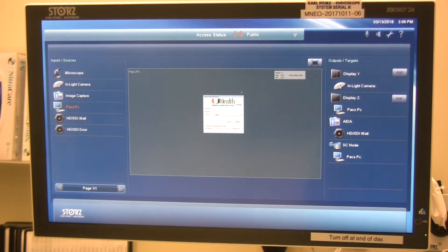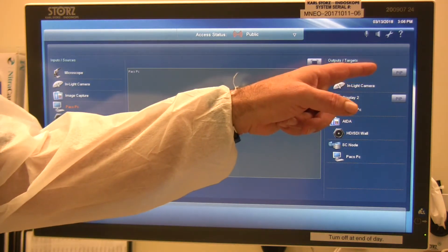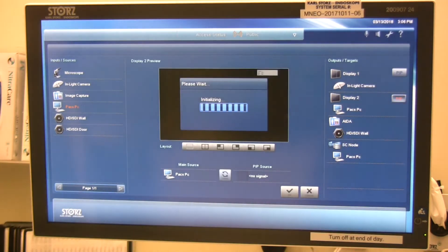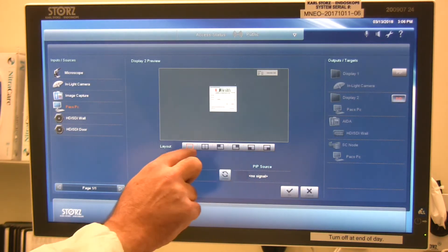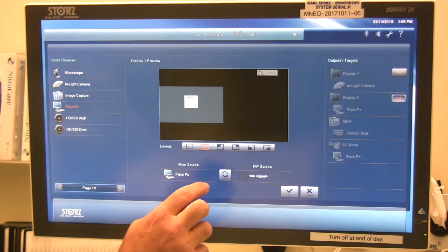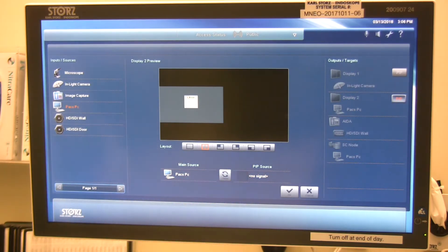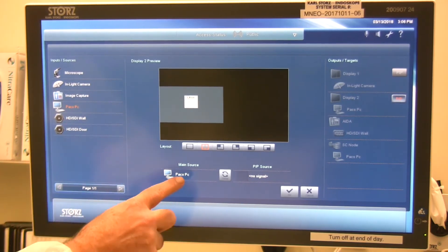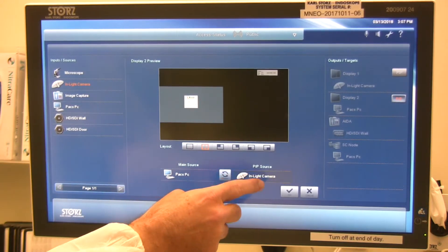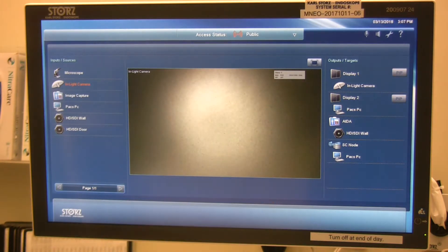Now we're going to talk about the picture-in-picture functionality. It is display specific, so there's a picture-in-picture tab for Display 1 as well as Display 2. If I select picture-in-picture for Display 2, along the bottom of the preview screen I'll get a number of different formats showing my primary and secondary sources. For this example I'll select side-by-side. I then select my main source — Pacs PC — and my secondary source — in-light camera — press it to secondary source, which gives a side-by-side view. I check OK and on Display 2 I am now routing picture-in-picture.